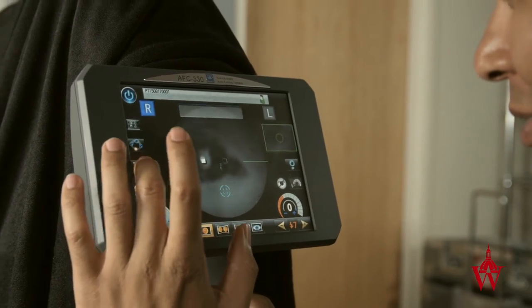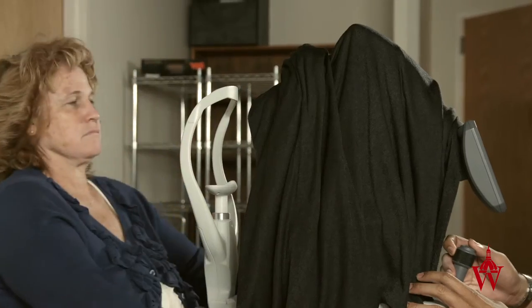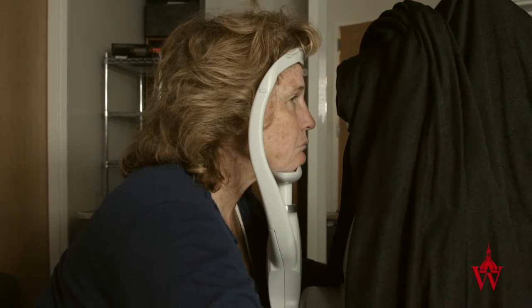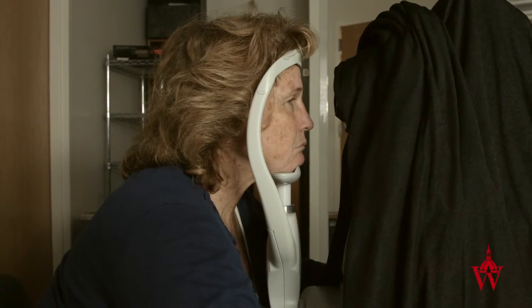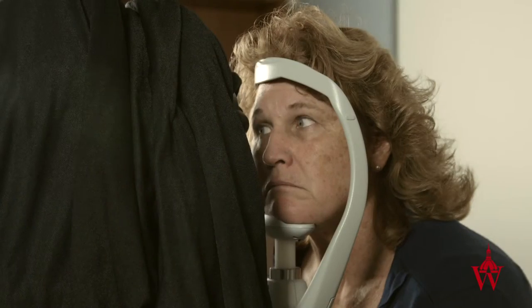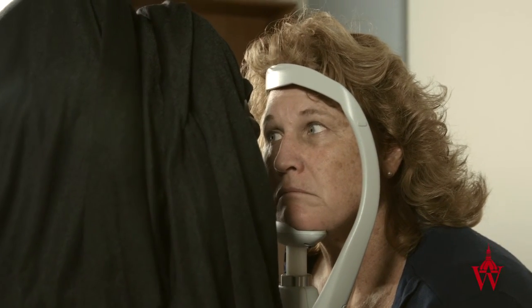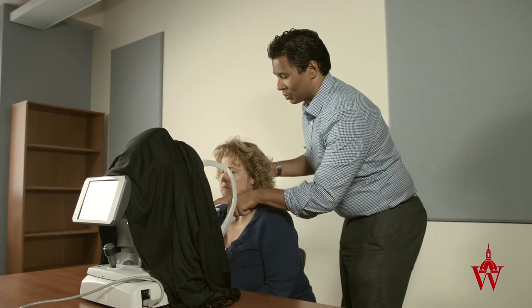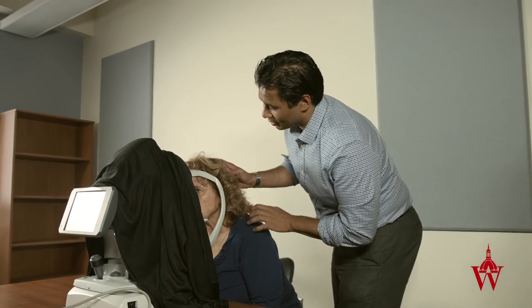If the patient gets shocked by the flash, lower the flash setting if you can while still getting a good picture, and tell the patient you will warn them before it flashes again. If the patient is misaligned and looking sideways, ask the patient to take their chin off the chin rest and completely reposition the head.